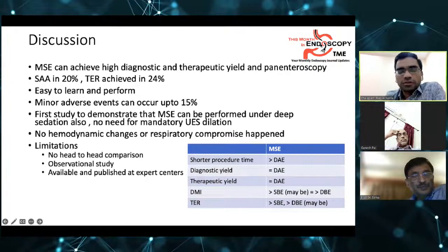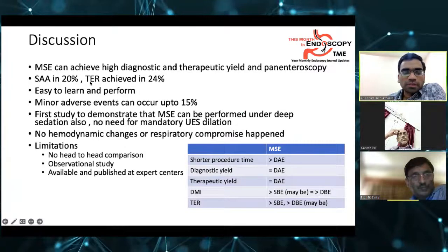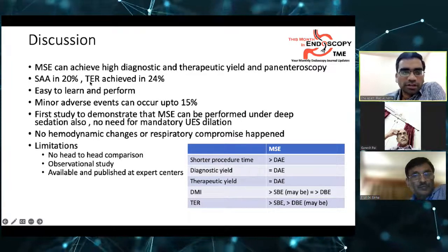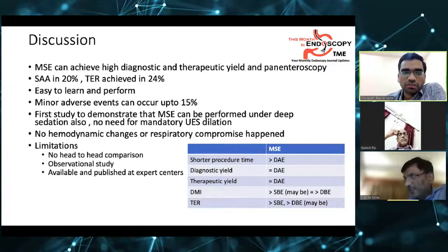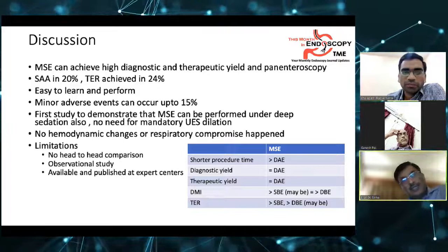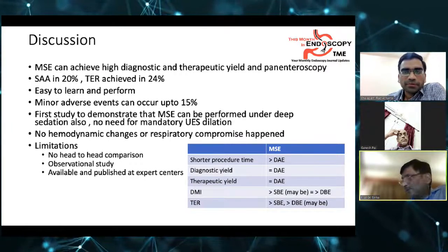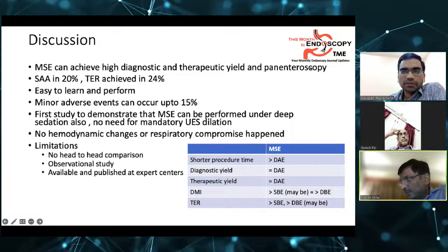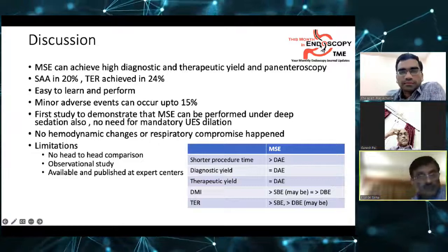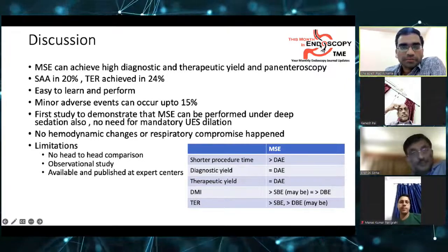That 24% is only the total enteroscopy, meaning reaching the cecum from the antegrade route, or in the bidirectional route reaching the point of the clip or the tattoo. In other patients, it was not attempted, not possible, or had to be discontinued for some reason. I found that information is not clearly available. Yes, that is not clearly available.